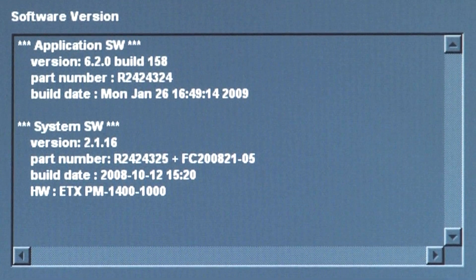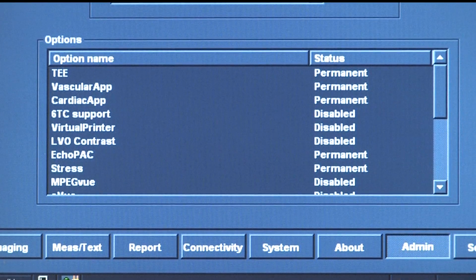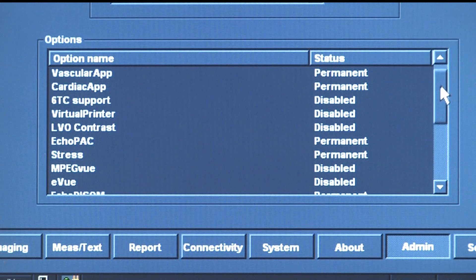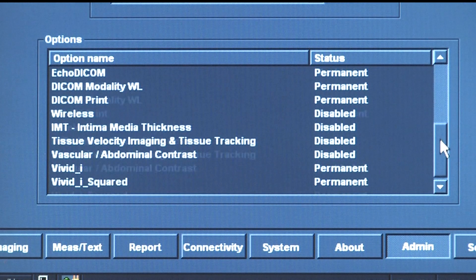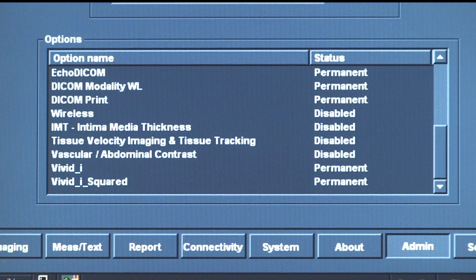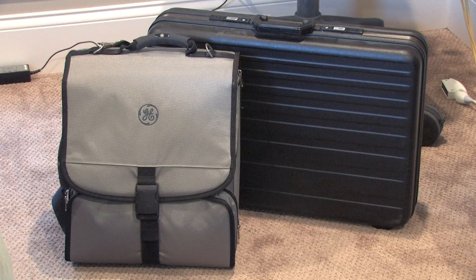This is the software version of the Vivid Eye. These are the installed applications on the Vivid Eye. There is also the bag for the Vivid Eye and the protective case for the TEE probe.